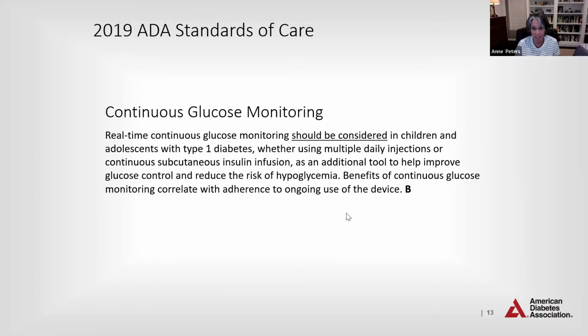And that was an RCT. We don't actually care. So here we're sort of saying, well, we still think it should be part of what we use for treating kids and adolescents, even though it was then and is hard to show consistent benefits because kids are kids, and most importantly, adolescents are adolescents, and it's hard to show a lot of improvement with some of these tools.